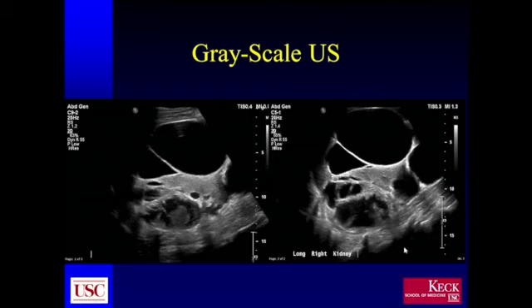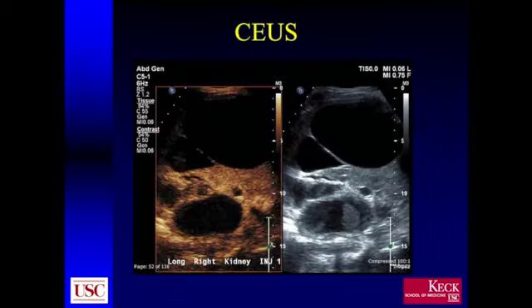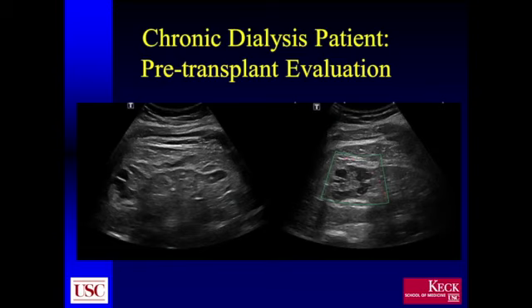So this was, again, further suspicion that there could be something going on here, but it was nicely confirmed as a hemorrhagic cyst on good old contrast ultrasound. You can see that within it, none of the solid material that we were seeing on the grayscale ultrasound actually proved to have vascularity, and this is the hallmark or typical picture of a simple hemorrhagic cyst in a polycystic kidney.